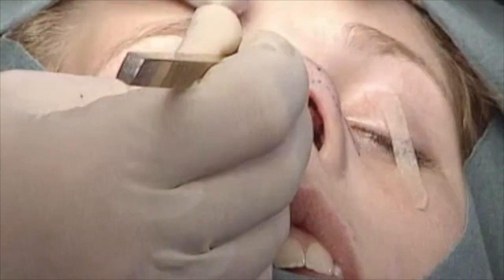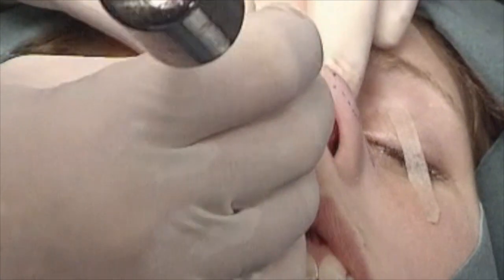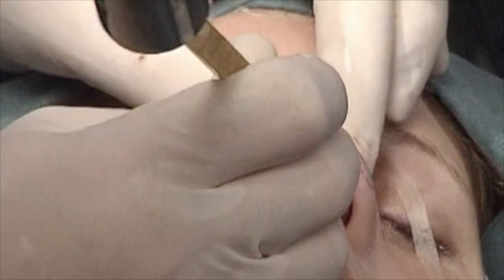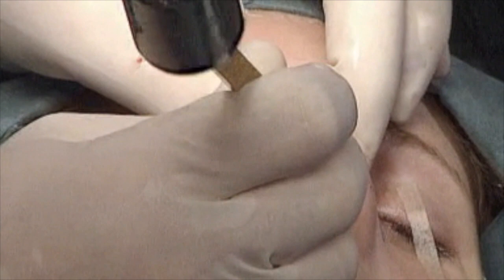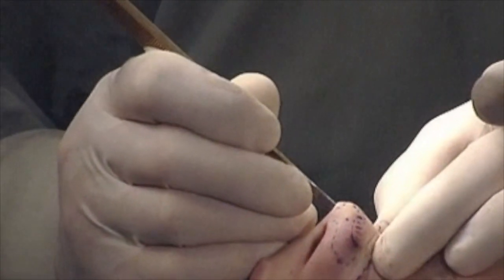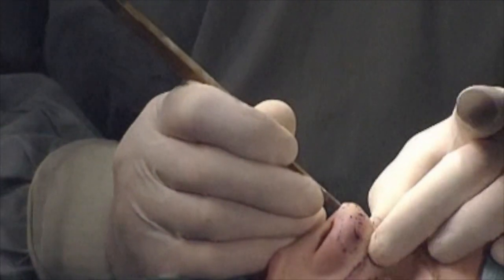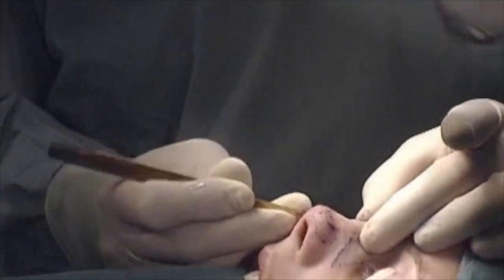Yes. Okay, quiet. Yeah. Strong bone. You hear a different sound, then it goes well.